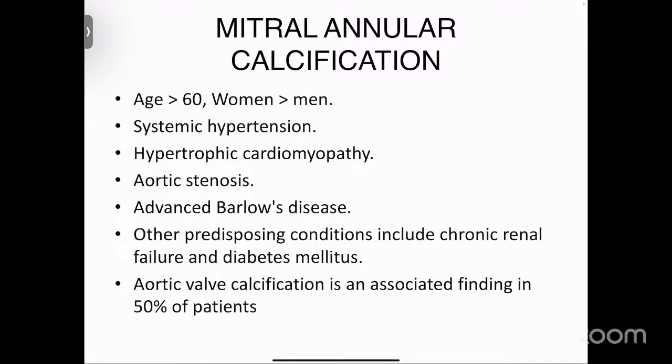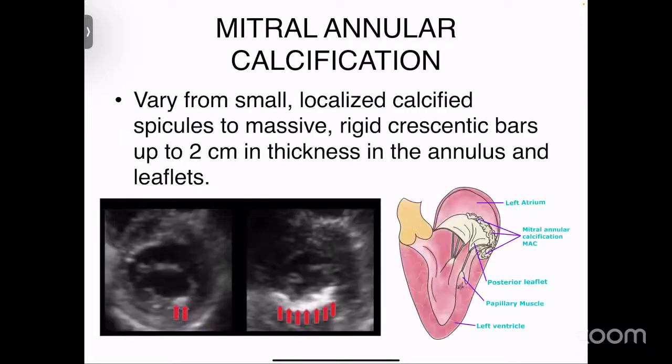And this is an echocardiographic image demonstrating the different extent of calcification along the mitral annulus.